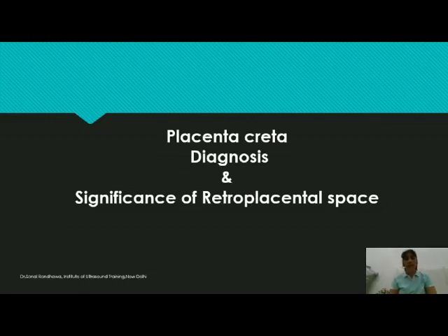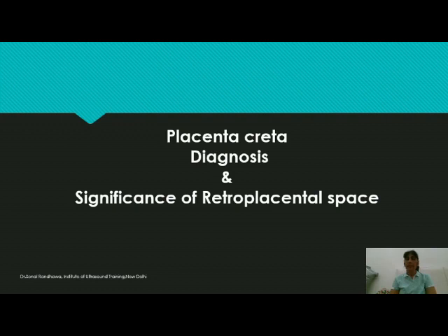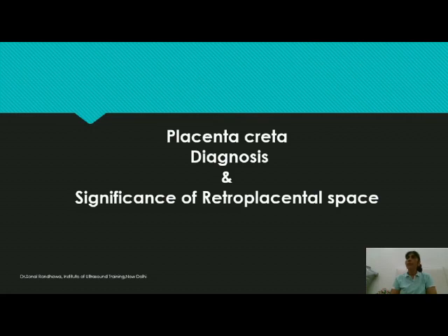Today we will be talking about placenta creta. Many times people tend to overlook this condition because they don't pay attention to the protocol that you should follow whenever you are doing any scan. You should always follow a protocol. For placenta, there are four to five points that you should assess, and one of the important points is the significance of the retroplacental space.